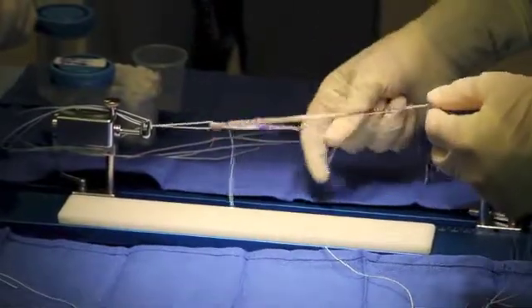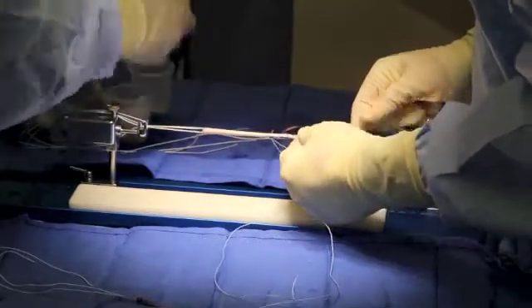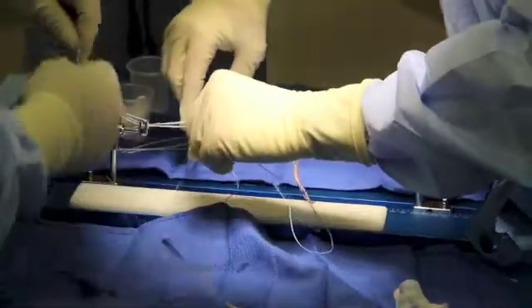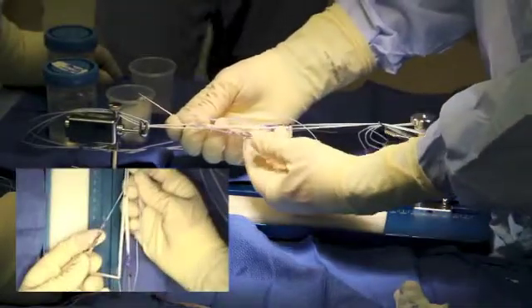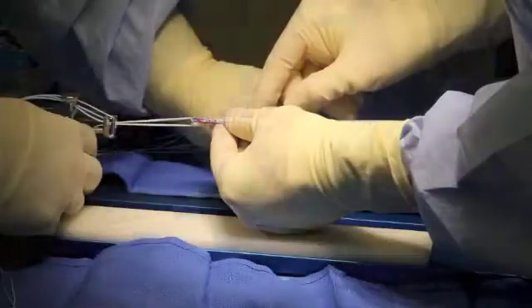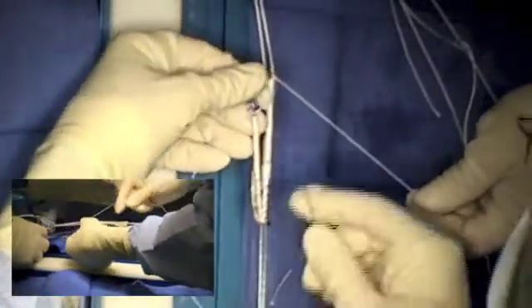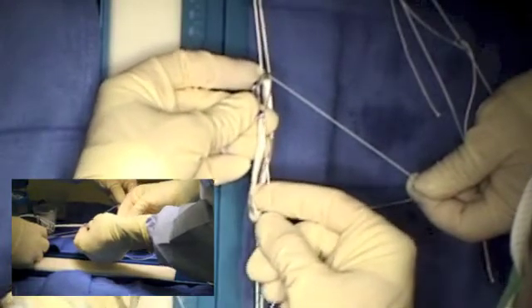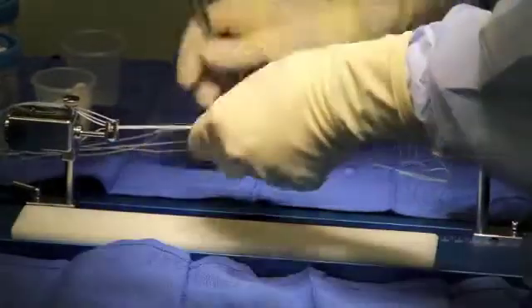First, the semitendinosus is passed through the loop to the first fold. The first two strands are tensioned and secured to the graft prep board via the fiber loops. Then the semitendinosus is passed through the loop a second time to the third fold, and this third strand is also tensioned. The needle of the fiber loop on this end can be left uncut or reloaded for securing of the third strand. The free ends of the fiber loop are secured back to itself upstream before the third fold at a position that adequately tensions the third strand. Note that the needle is not being passed through the graft, but through the loop of the suture. The suture is then tied and cut.